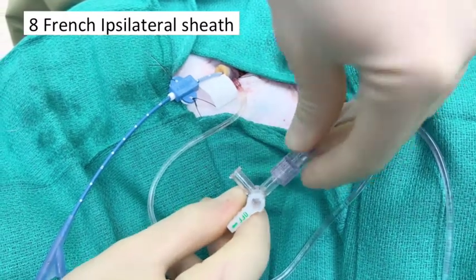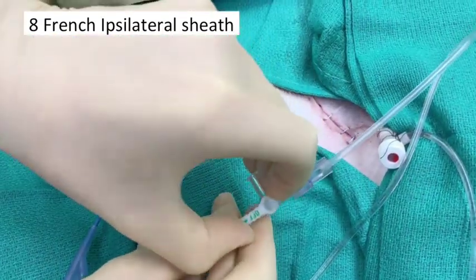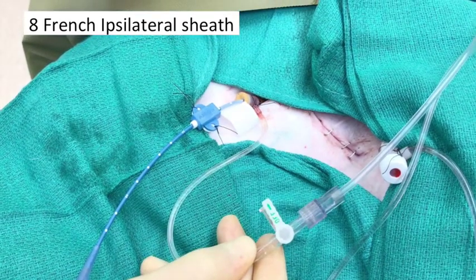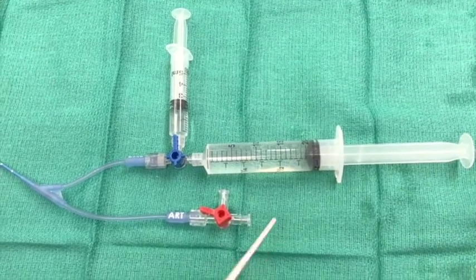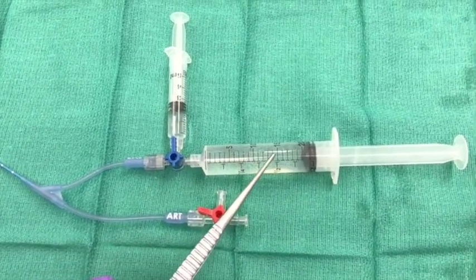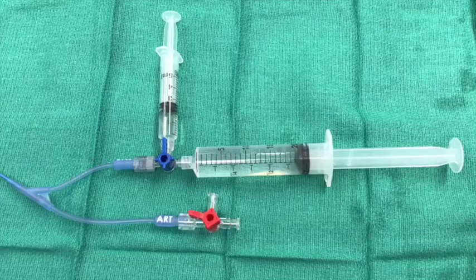The technique is demonstrated in this porcine hemorrhagic model. You can see the REBOA is already in place, and we've taken the side port of the 8 French sheath — which I commonly utilize in clinical practice — and connected it to an A-line to measure blood pressure below the balloon. I also place a three-way stopcock and a 3–5 cc syringe at a right angle to the larger syringe used for insufflation, as this affords more precise control of balloon desufflation to achieve partial REBOA.